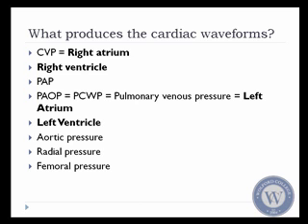pulmonary capillary wedge pressure. The pulmonary capillary wedge pressure, in reality, is only done in the cath lab, when a cardiologist actually takes a catheter and wedges it into a capillary. This is fraught with danger in the clinical area because it could erode the capillary wall and would very likely cause hemorrhage into the pulmonary artery. So instead, we use the occlusion pressure technique using a balloon, so that's why we call it the pulmonary artery occlusion pressure. If you're still using the nomenclature of pulmonary capillary wedge pressure, you really should change it to the PAOP, which is more consistent with what you're doing.